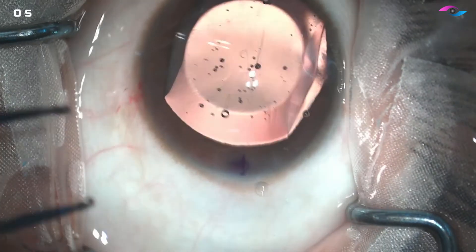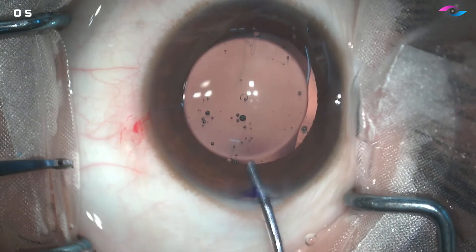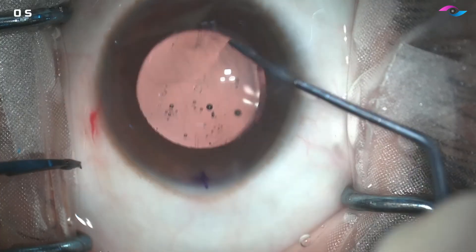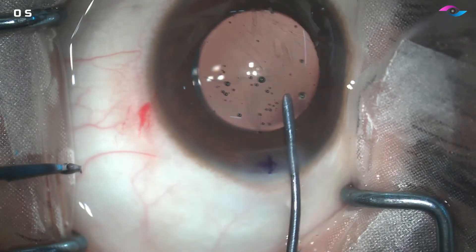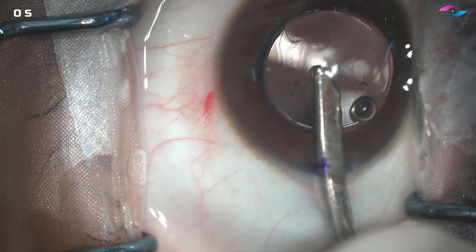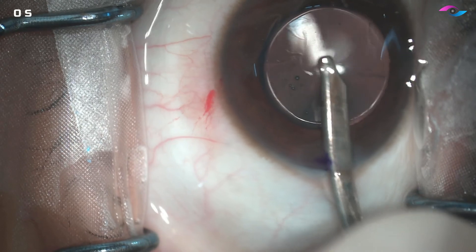We have to ensure that no haptic is out. Then we gently rotate the lens to ensure the correct orientation, well aligned with the marks we previously created. We avoid touching the optic of the ICL at all times. Then we use a simcoe to wash off all of the viscoelastic at the end of the surgery.